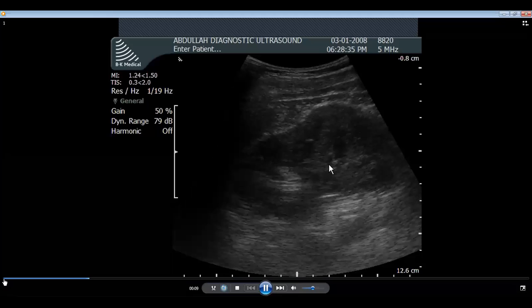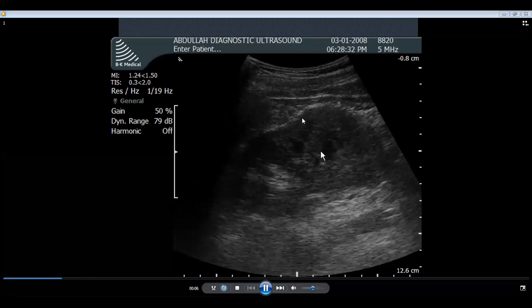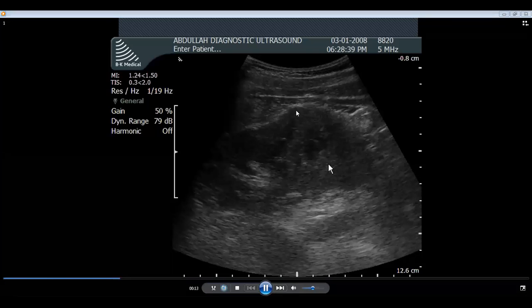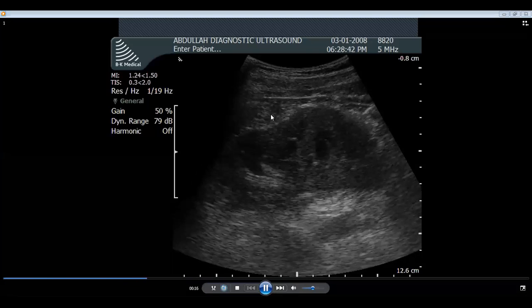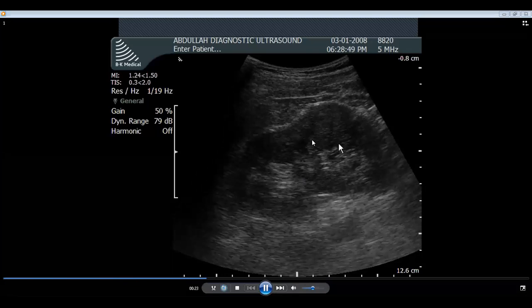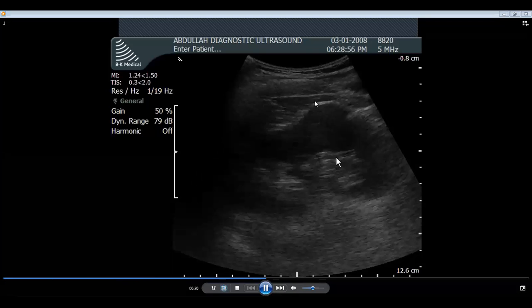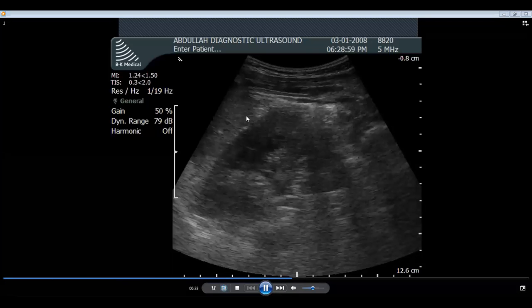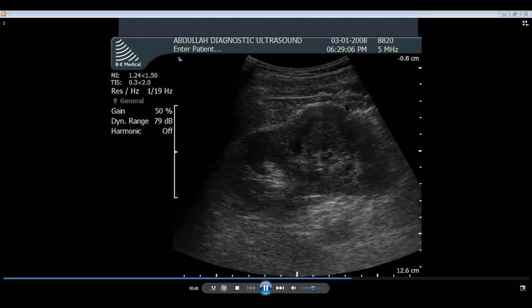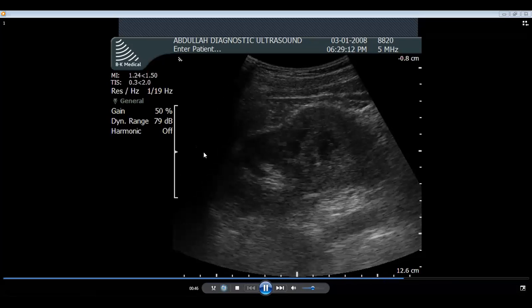There we see the outline of the kidney, and usually in the left kidney, we find a hump here in the middle pole called dromedary hump. It is because during intrauterine life, the spleen keeps on pressing upon the upper pole of the left kidney, and the parenchyma is pushed towards the middle of the kidney where it produces a hump. So this hump or bump is seen on the renal surface, which is called dromedary hump, a hump of a camel. This is how it appears and should not be confused with any growth.